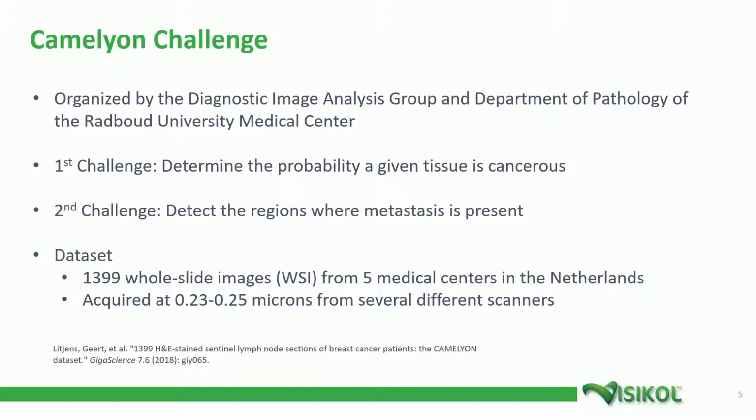The dataset consists of almost 1,400 whole slide images from 5 different medical centers in the Netherlands. These images were acquired at 0.23 to 0.25 microns from several different scanners.